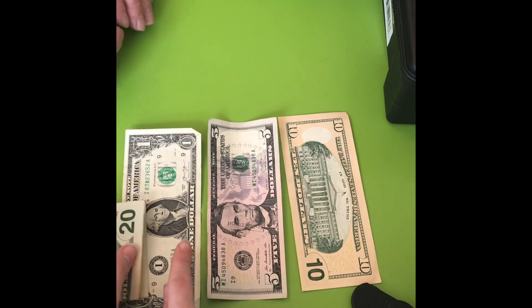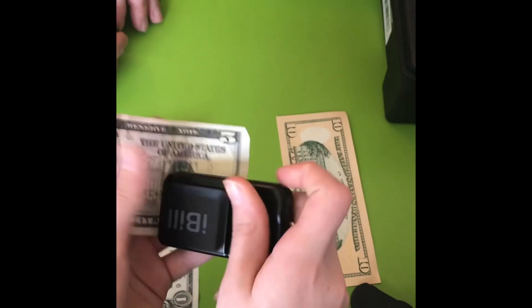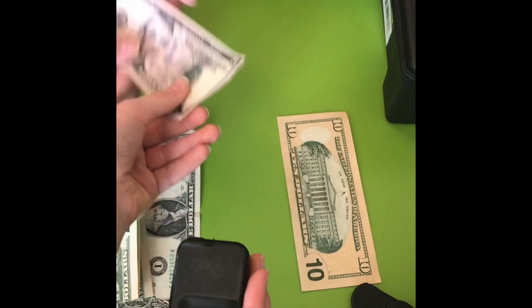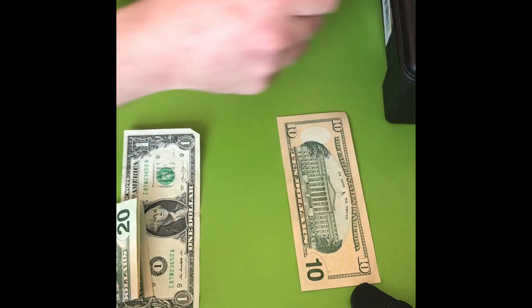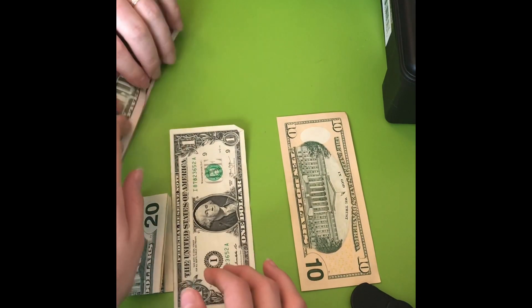So let's try another bill with the iBill. That's going to be a $5. Let's see what the iPad app says. $5. Exactly. I fold the $5 only length-wise, so it's going to be like a long thing, and that's how I put it in my wallet.